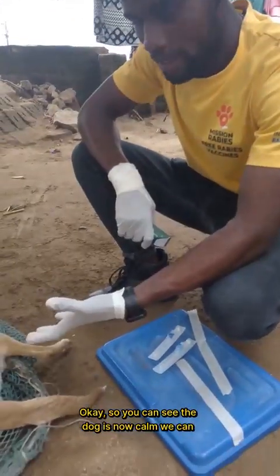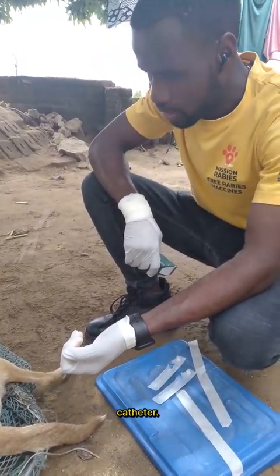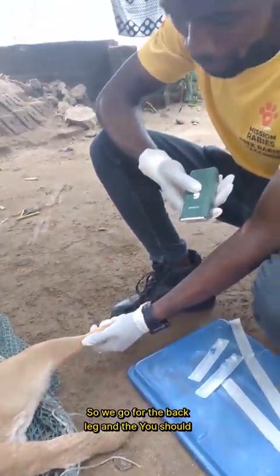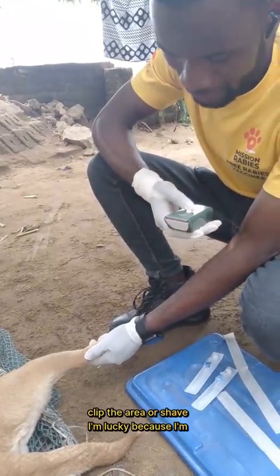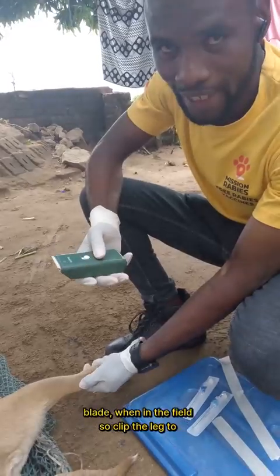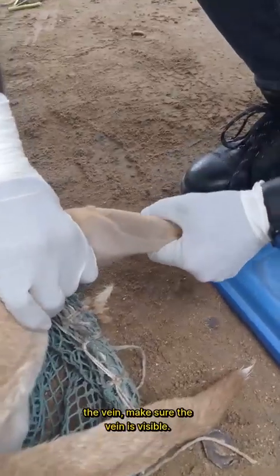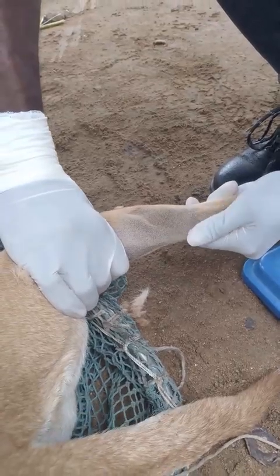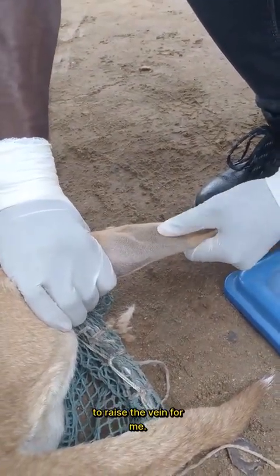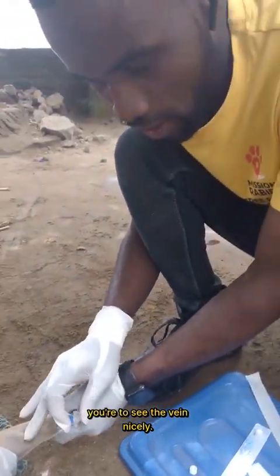Okay, you can see the dog is now calm, good to go with the placement of the catheter. We go for the back leg, and you are supposed to clip the area or shave. I'm lucky because I'm using this clipper, but sometimes in the field you can just use a blade. Clip the leg, expose the vein, and make sure the vein is visible. I'm going to use my colleague just to help raise the vein for me.